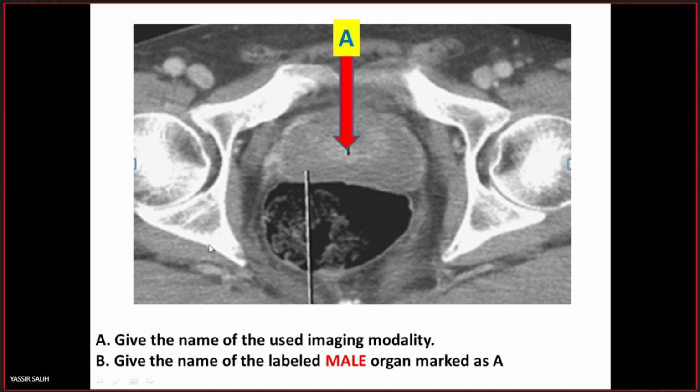Look at the bone. Bone in CT is very dense, very bright. So this is a CT. What is this structure? Yes, there. And what is this?